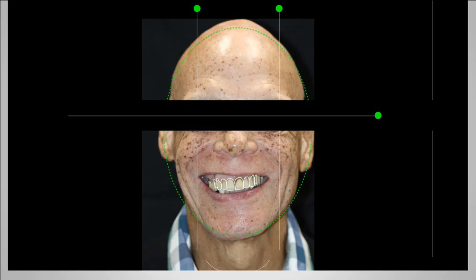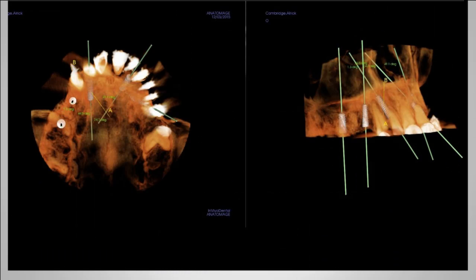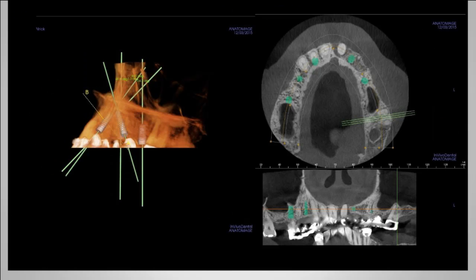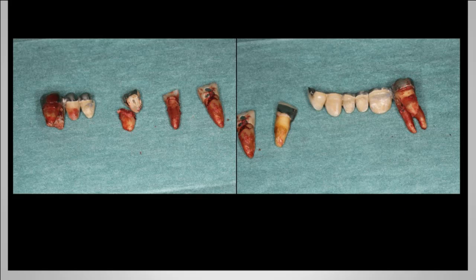We've done a little bit of facial analysis, and we've discovered that when we've analyzed his face, basically his jaw is canted and his teeth are canted. And by looking at how we reconstruct his teeth without having to carry out osteoplasty with this part of his jaw, we've been able to begin the reconstruction process.